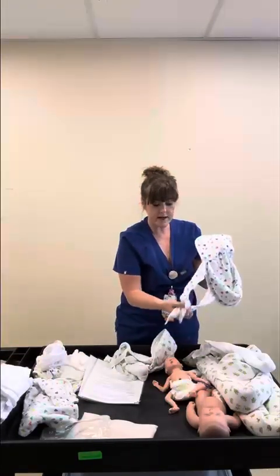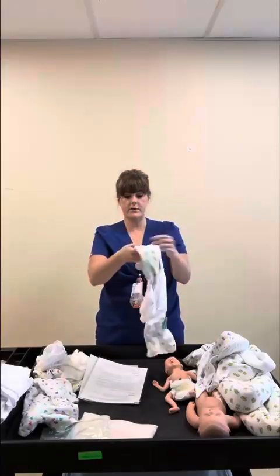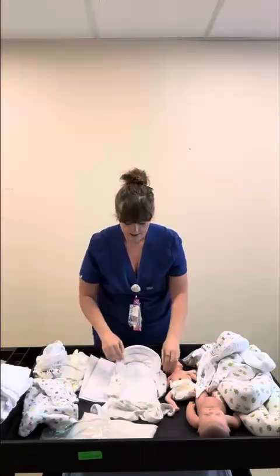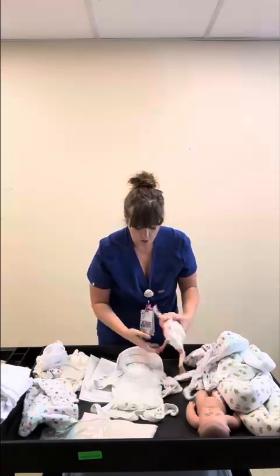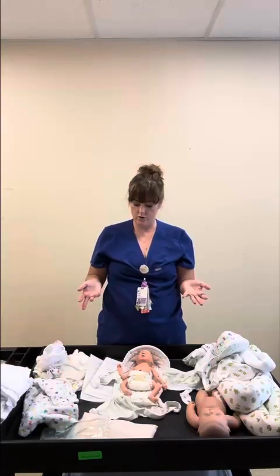But the goal is to have this kind of stretchiness so that babies can get that resistance as they grow their bones and muscles. So the RU2 is a little bit different, whereas this is designed to be on the head part, not the feet part. And the baby can be kind of swaddled once they hit 1,200 grams. Please don't swaddle them in a cloth diaper. Please don't dress them yet. This is still, they're naked, but now they're transitioning to air control. And we do want to give them a little bit of that ability to kick and stretch against the fabric.